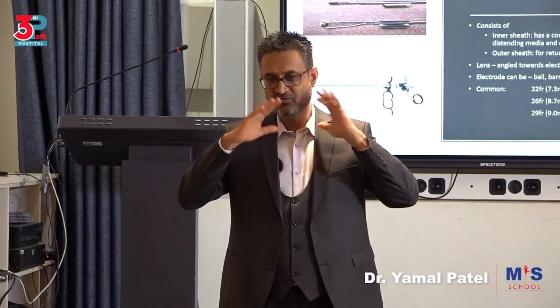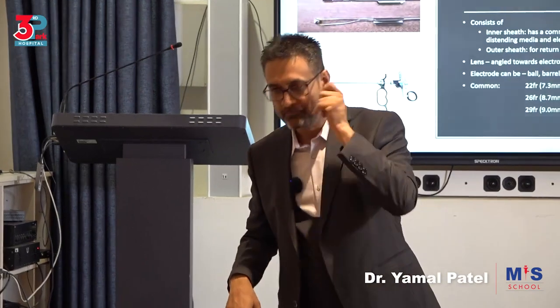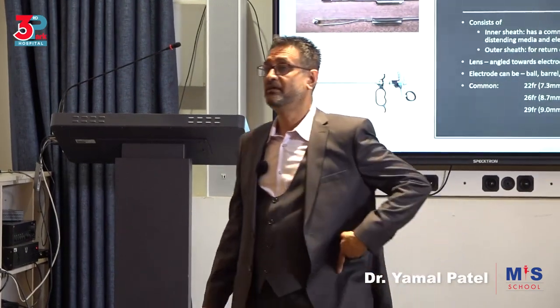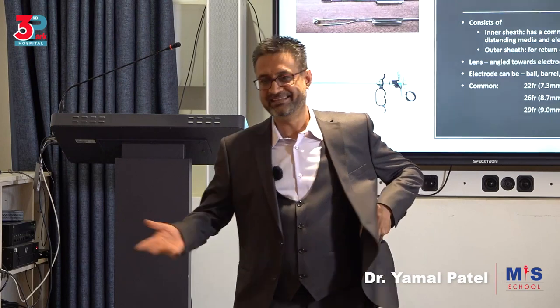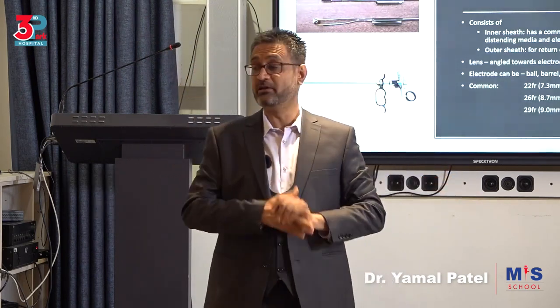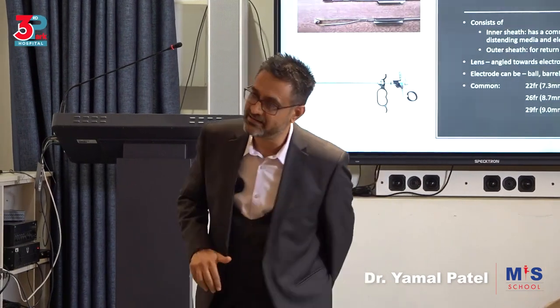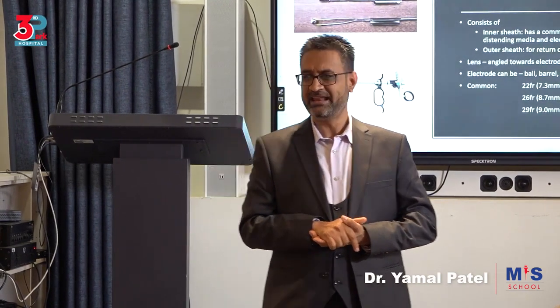You know what I mean. You're using saline to do hysteroscopy, right? You've used a monopolar resectoscope by mistake. You were not told this is bipolar. You were given a monopolar resectoscope because those are the old ones that we always have been having. And you activated a monopolar resectoscope in the patient while it is in the uterus. What happens? Any guesses?